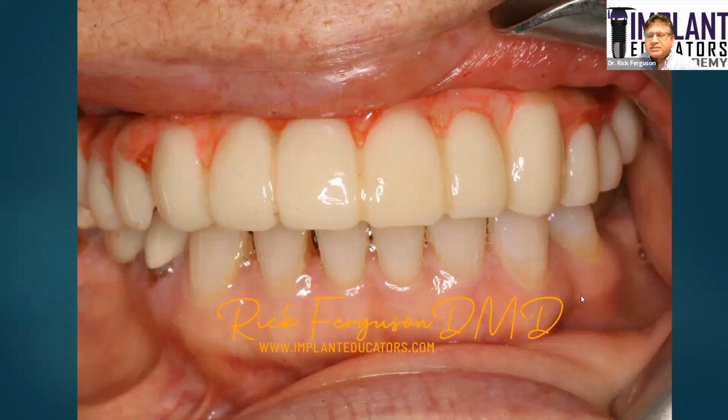All right, so that's another technique that we are doing, but it's not mainstream at this point, in my opinion. All right, so look for new things coming from that realm as well. I'm trying to develop a lower cost technique rather than photogrammetry, using Michael Ferguson's impression inversion technique. So look for that coming soon, okay?